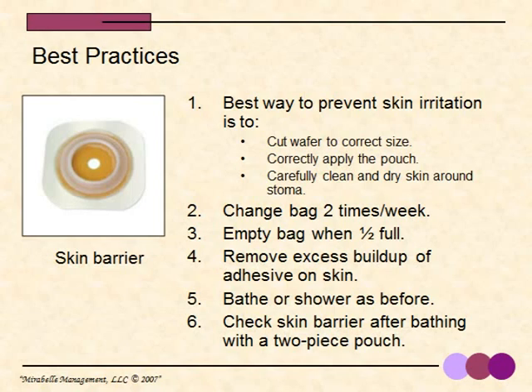I've included a few best practices to help you in caring for an ostomy client. The best way to prevent skin irritation is to cut the wafer to the correct size. Less than 1/8 of an inch of skin should show between the wafer and the stoma. Correctly apply the pouch. Make sure that it's aligned correctly and that there are no wrinkles in it. Carefully clean and dry the skin around the stoma.